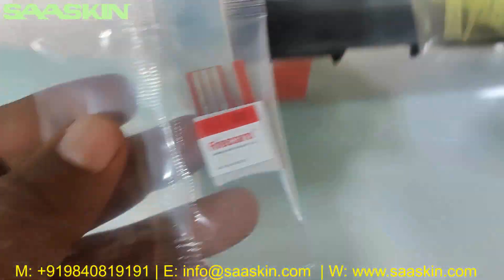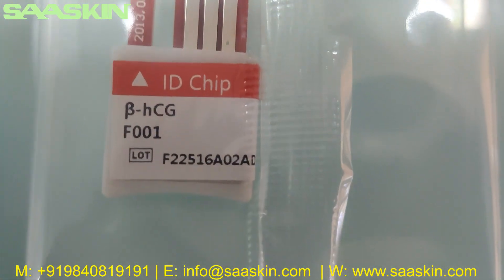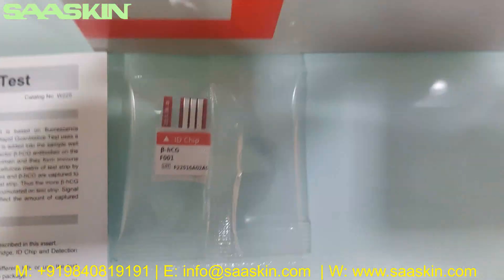You can see another chip — one chip here. In the chip you can see the test type and the lot number is mentioned. And then you have 25 pieces of paper tips — you can see the 25 pieces of paper tips here.